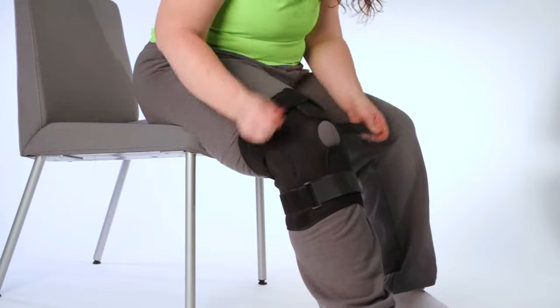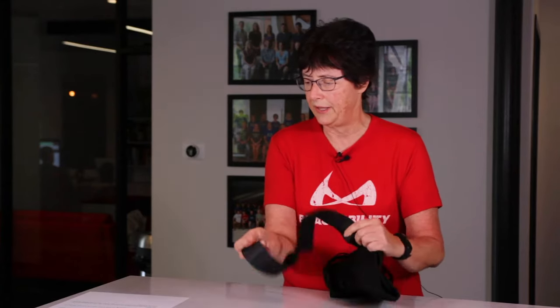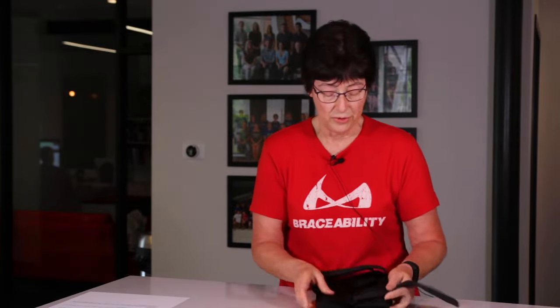It's also especially useful for those people who carry around additional weight. Due to the thicker material of this brace many of our customers find it difficult to wear under clothing, so many prefer to wear it with shorts or over their pants. If you're looking for a low profile lightweight support for your knee, this is not going to be the brace because it's for moderate to heavy duty support.